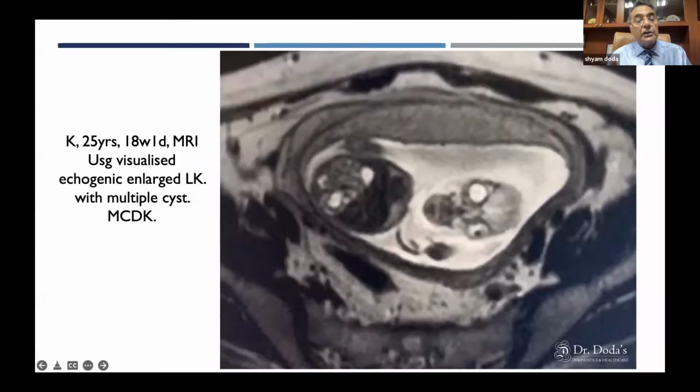So in this kind of situation, sometimes you need the help of other imaging modality to raise your level of confidence, in spite of knowing that, yes, you probably are correct. And there we find that, yes, we have a nice interaction between the MRI and fetal ultrasound people.